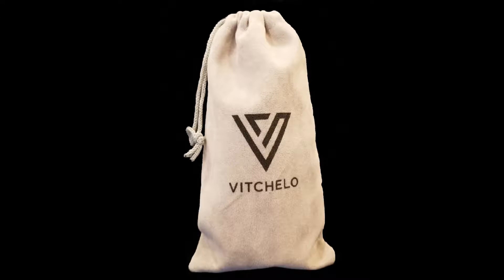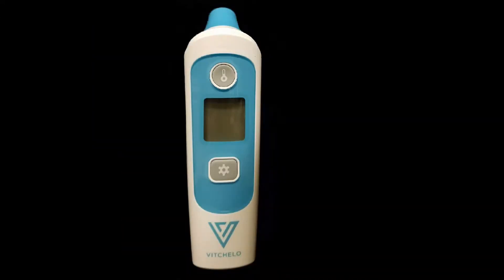It comes in this cool little package and here it is. It's really simple to use. First things first, open up the battery compartment because the batteries come plastic-wrapped. You can have Fahrenheit or Celsius depending on where you are. Press this button down for about four to five seconds.